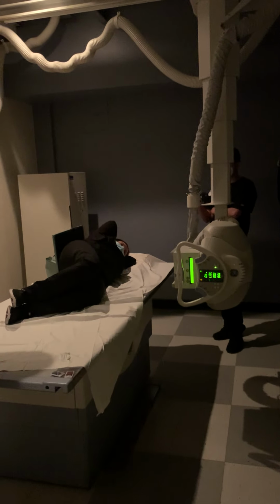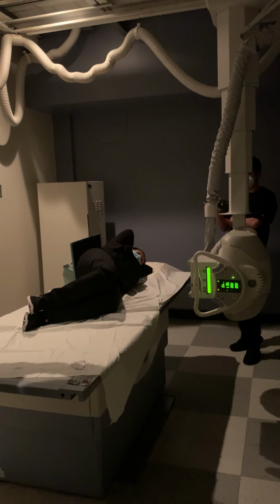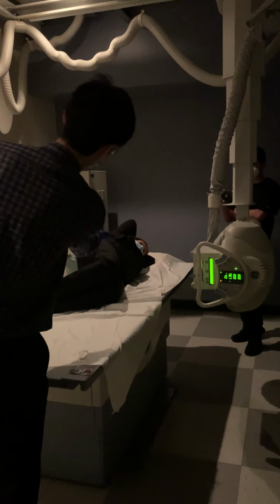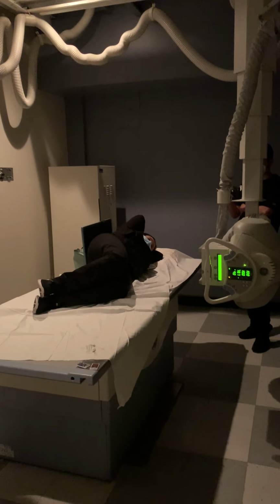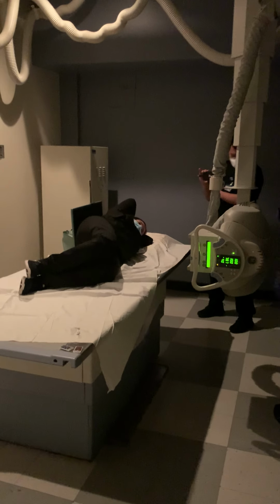A lot of times there's going to be a CPR cart in the department. CPR carts come with this white backboard. You take that white backboard, just slip it underneath the patient's side, and that kind of gives that flat, hard surface for the patient to lay down on.